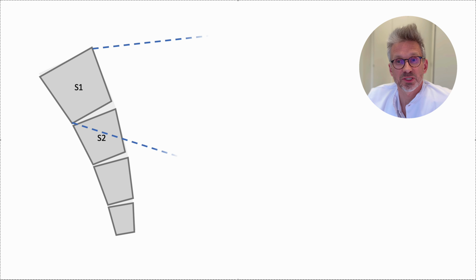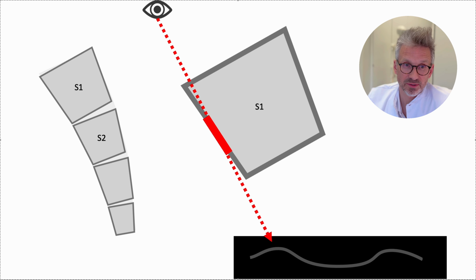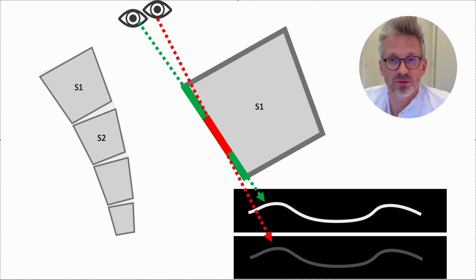Percutaneous screw osteosynthesis is the preferred method in fixing the posterior pelvic ring. A major challenge remains the intraoperative imaging, which can be hindered by weak contrast. In conventional S1 screw placement, surgeons must estimate the optimal inlet and outlet views by trial and error. But when the X-ray beam aligns tangentially with the structure of interest, absorption is maximized, resulting in a high contrast.